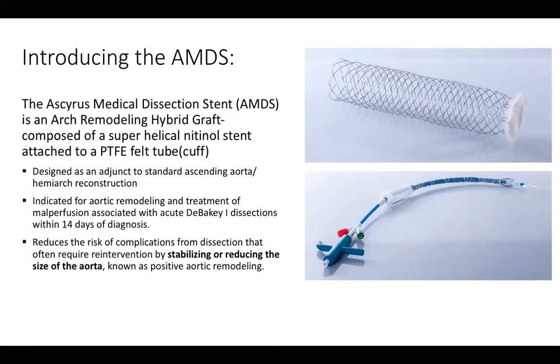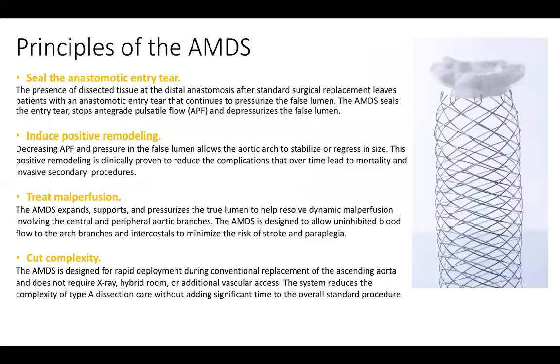And it's designed as an adjunct to the standard type A aortic dissection repair. So again, this is not a setting where advanced aortic techniques are necessarily required. And one of the greatest benefits is that it's quite simple and easy to use. One of his main goals was that this does not have to be done by an aortic surgeon or an endovascular surgeon. This is really for any cardiac surgeon to be able to use in a fail-safe manner, and I think he's really accomplished that.